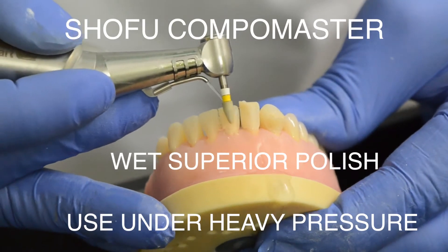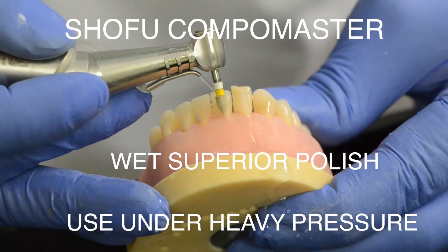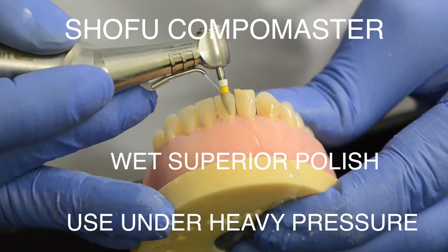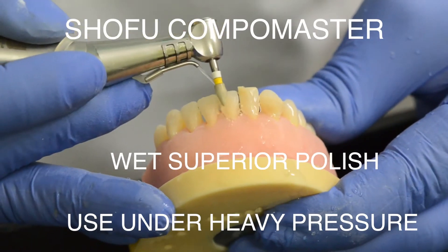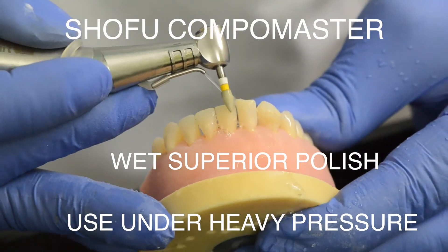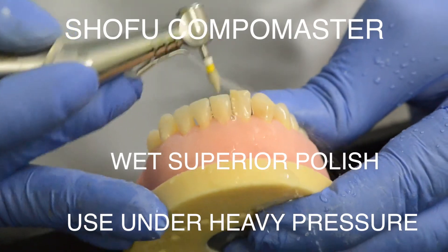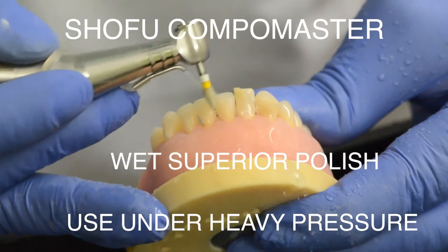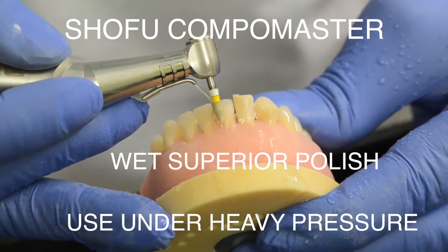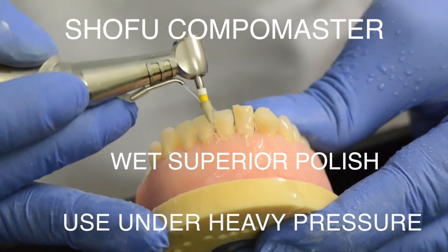Now we move on to the final polishing step, where you use a rubber bonded abrasive with diamond particles impregnated into a shaped rubber, used under water with an air motor or micro motor. At this point you want to use quite heavy pressure — you literally have to see this rubber point reducing in size as you polish.